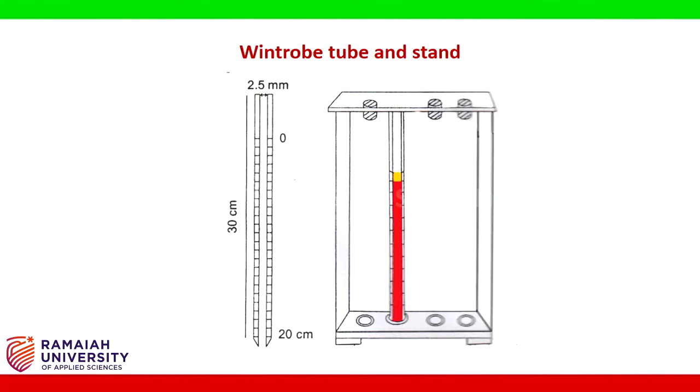Blood lancet. It is a small medical implement used for capillary blood sampling. It is used to make punctures such as finger stick to obtain small blood specimens and generally disposable.